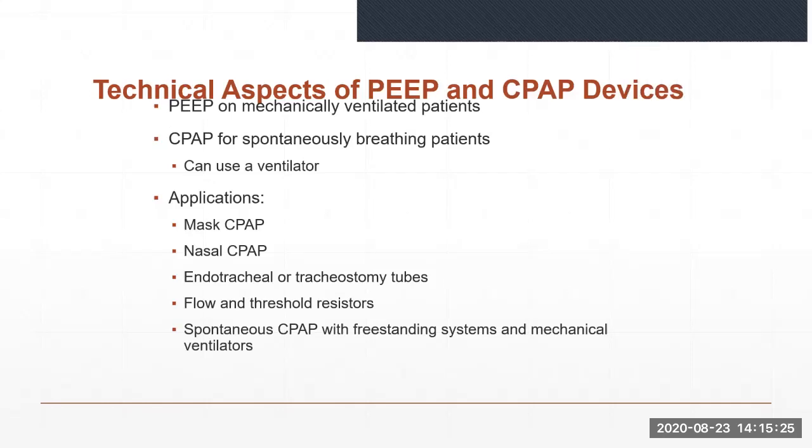Generally, PEEP is used when a problem in the lungs results in collapse of alveoli and small airways. If a significant number of alveoli collapse, more areas of the lungs are perfused but not ventilated, resulting in a shunt-like situation. When PEEP is set on a ventilator, the expiratory valve of the ventilator closes when the expiratory pressure drops to the set PEEP level. This traps a certain amount of pressure and volume in the lungs that can prevent or reverse alveolar collapse and reduce the amount of pulmonary shunting.